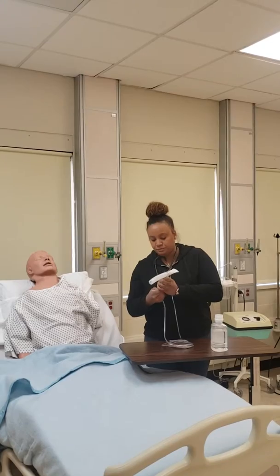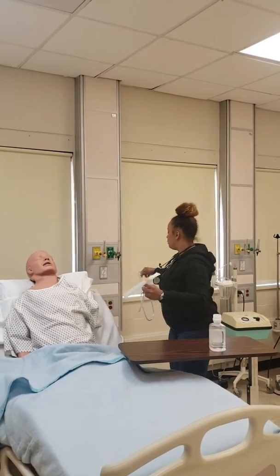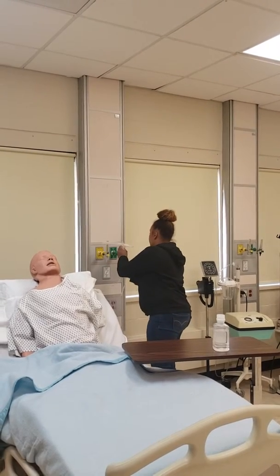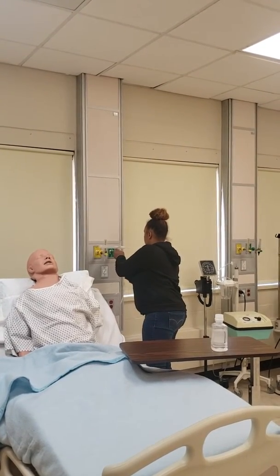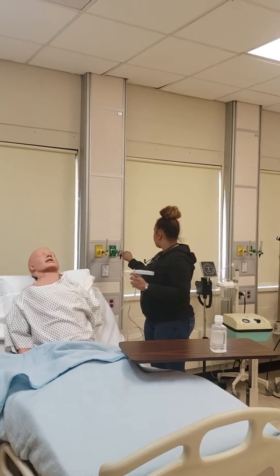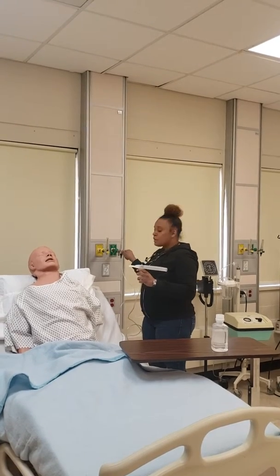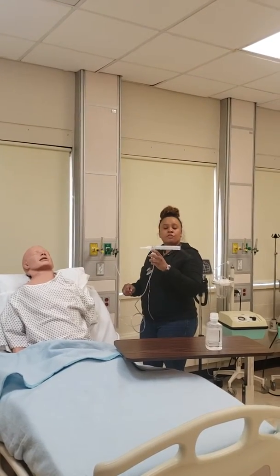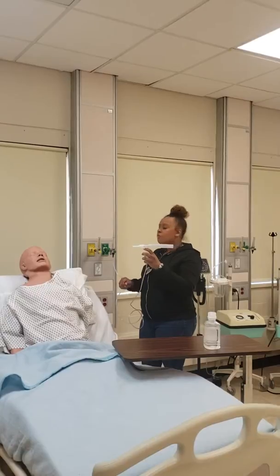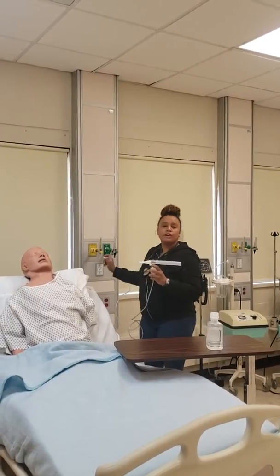I am now attaching my small volume nebulizer tubing to the flow meter, which I will turn on, and I will adjust it to 6 liters per minute. If there was not enough aerosol being produced, I will adjust the flow meter to 7 liters or 8 liters per minute.